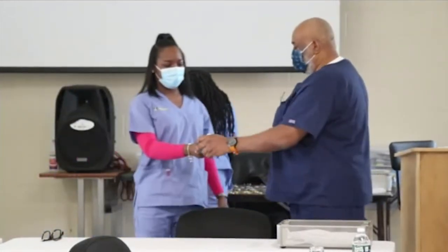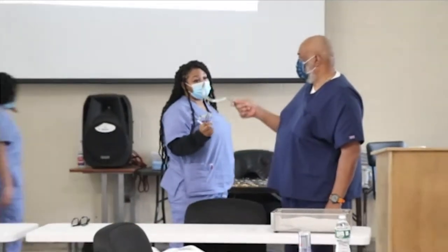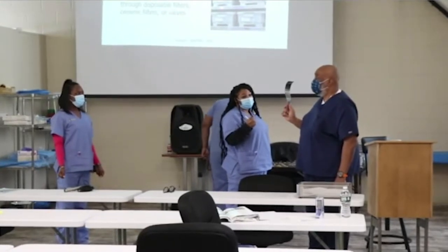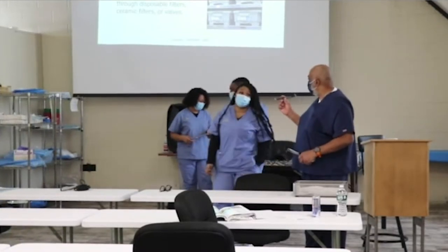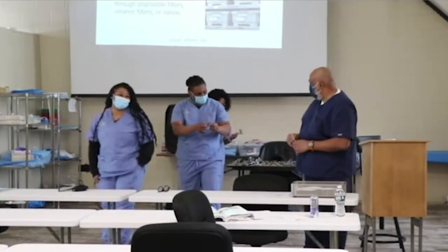Retractors. Give me a Deaver retractor off the table. Give me an Army and Navy retractor off the table. Give me the Adson Beckman off the table. Give me a Weitlaner off the table. Deaver retractor. What is it about the Deaver retractor? They come in different sizes. Different sizes. It's a handheld retractor. Are there any other types outside of handheld? Self-retaining. Thank you. What's this again? The Army and Navy. Handheld or self-retaining? Handheld. Excellent.